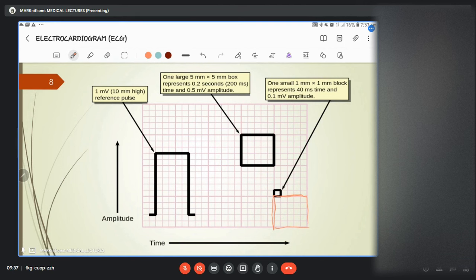So when you pick this ECG graph, what you need to confirm is these boxes. Are the small boxes in this big one up to 5? Vertically, yes, 1, 2, 3, 4, 5. And horizontally, yes, 1, 2, 3, 4, 5. So you've confirmed that. However, when you're talking about the big long box, that means 2 of this.